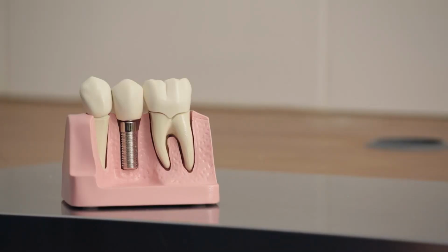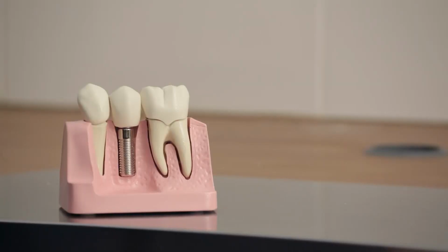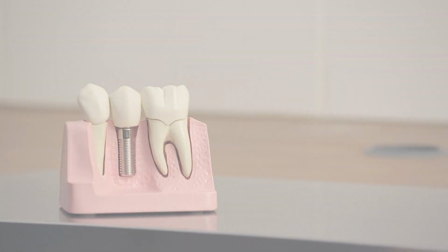Another advantage of having an implant is that because it's attached to the jawbone, it stimulates the jawbone like a natural tooth. If you were to leave a missing tooth space for a number of months or years, over time you will lose bone around that area. And over a long period of time, it may be more difficult to have an implant there in the future. With an implant in place, it stimulates the jawbone like a natural tooth does. So the bone around the implant is stimulated by the pressure or stress of normal eating function.